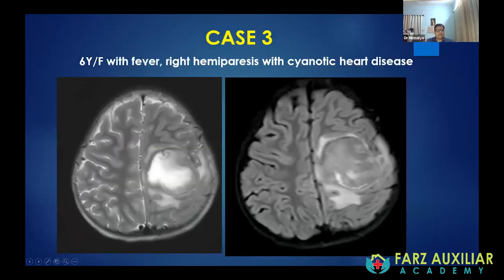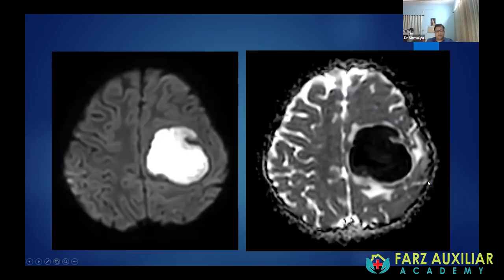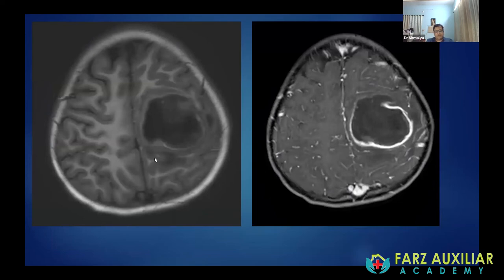The third case is a six-year-old female with fever and right hemiparesis, with a history of cyanotic heart disease — tetralogy of Fallot. On T2, there is a well-defined hyperintense lesion with surrounding edema; the signal is partially suppressed on FLAIR. On diffusion-weighted imaging, the lesion shows intense diffusion restriction — appearing bright on DWI and dark on the ADC map. On post-contrast T1, there is peripheral ring enhancement with central non-enhancement. This is a classic case of a pyogenic cerebral abscess.